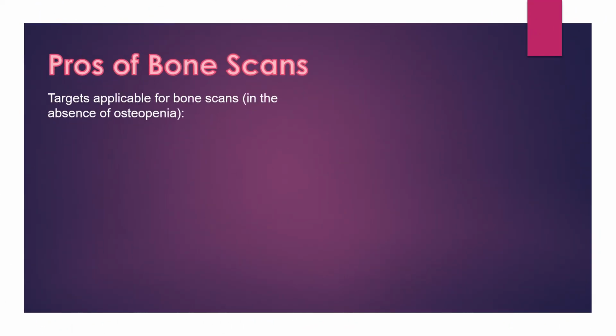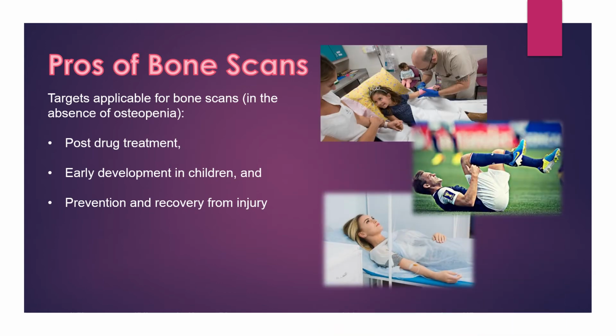Assessing bone scans has benefits in prevention of injury and fractures, not only for sufferers of osteoporosis, but may also be applied for persons in response to treatment of drugs, bone growth development in children, and prevention and recovery from sports and physical exercise.